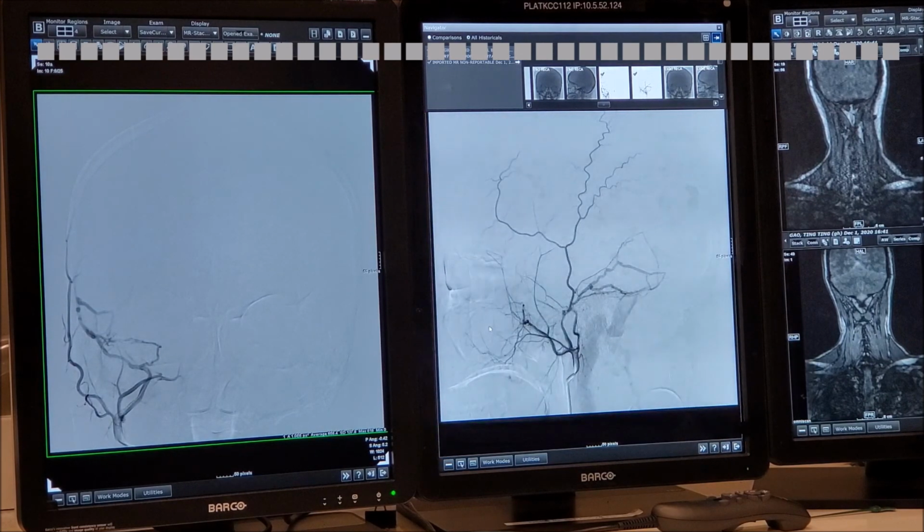Okay, so we're going to analyze what's the blood supply here. It's a nice variation of the meningeal artery, right? What artery is supplying the lesion? Don't tell me external carotid. That doesn't exist here. No, of course, it's not the external carotid. So how do we identify it? What is this one? And how do I know? Ascending pharyngeal? No. You know it's my favorite artery, but it's not the ascending pharyngeal.